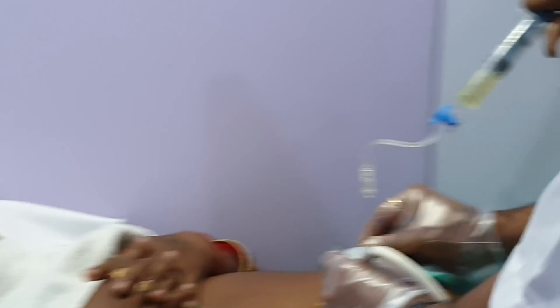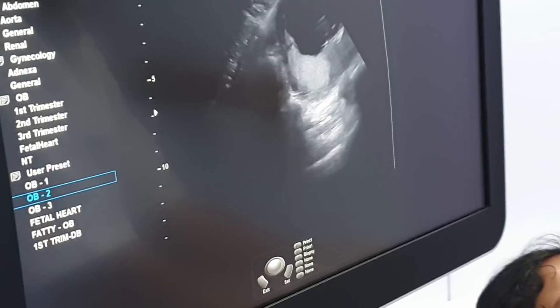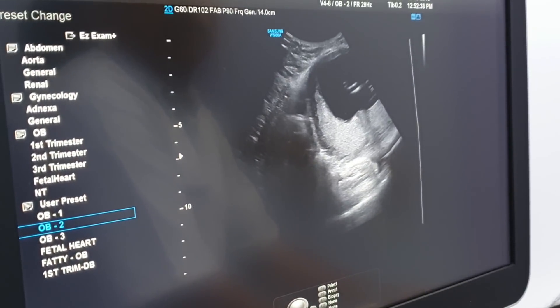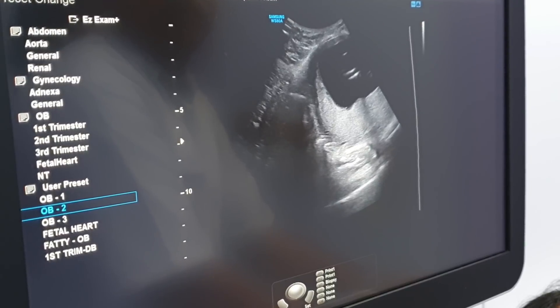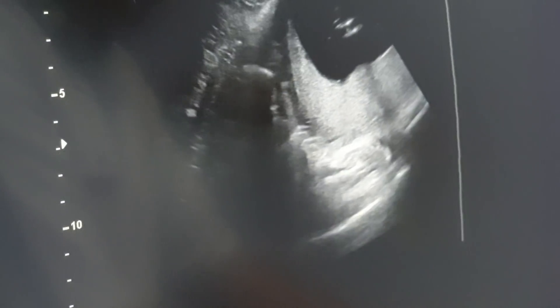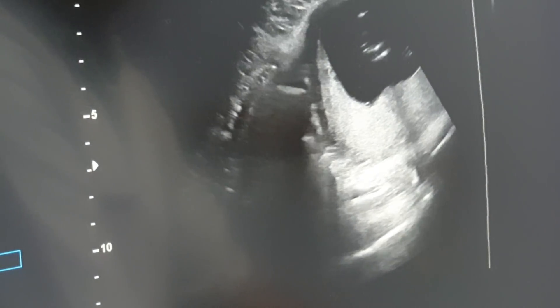What do you see? You can see the needle inside. I am moving the needle slightly. You can see the needle tail. We will take 15-16 ml. I think it is over.